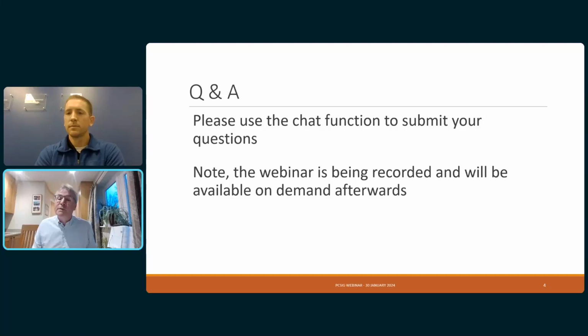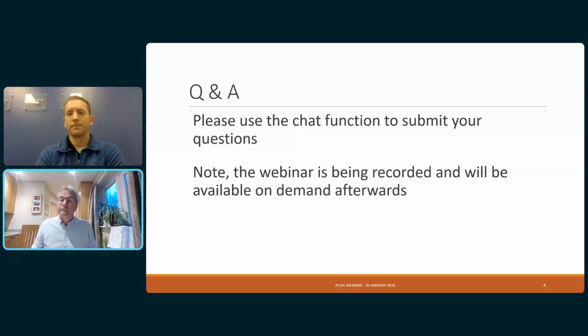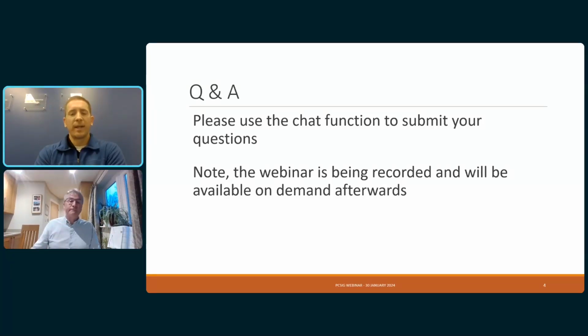Question from Aziz. What is the percentage of invalid samples due to imperfect collection? That's a good question. It's going to depend on the study indication and how difficult it is to collect that sample. I would say probably about 10%. Okay, which is quite high. Was that no sample being able to be analyzed at all, or just one of the replicates? Yeah, I would say one of the replicates being affected in some capacity. It's more common that the samples are underfilled than overfilled, and so there would still be replicates available.